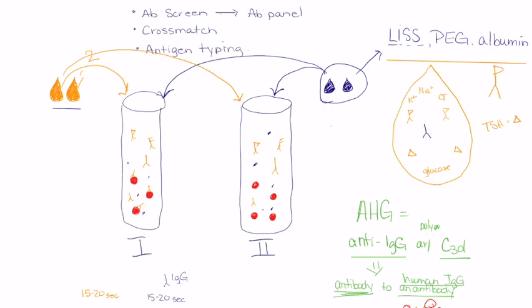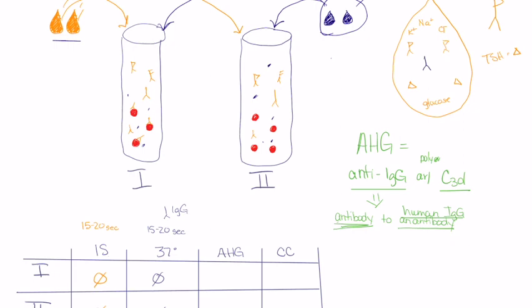Now, it doesn't distinguish between different IgG antibodies. Say, for instance, if we had over here, I'll just put it right below it, our chickenpox antibody, and let's make this our red cell antibody that we're trying to find. When we add this AHG to it, it is just going to bind to anything that is an IgG antibody. So it's going to bind to both of these indiscriminately.